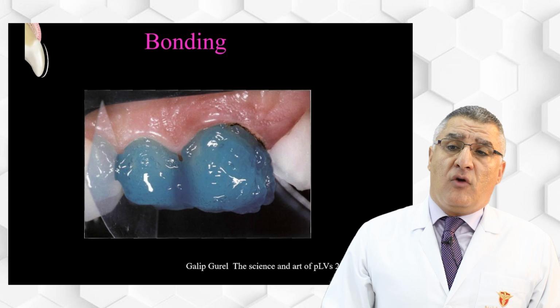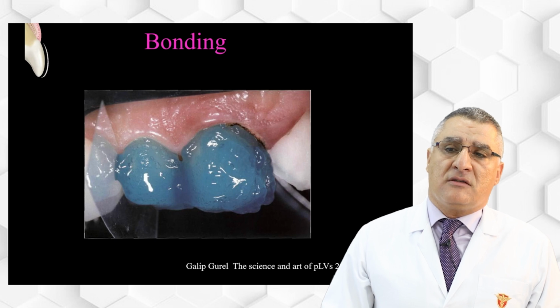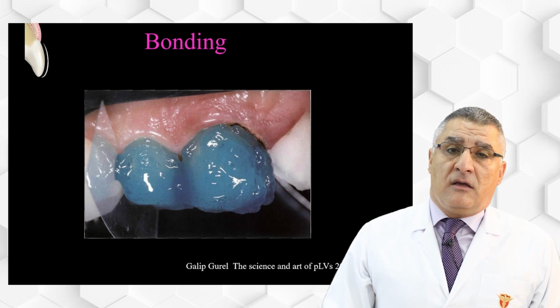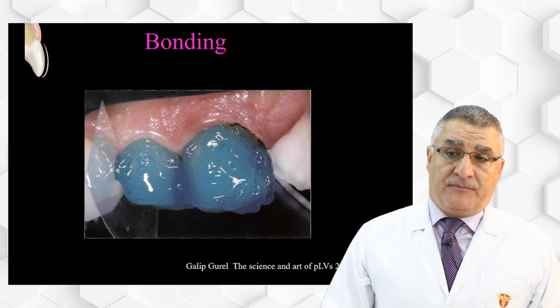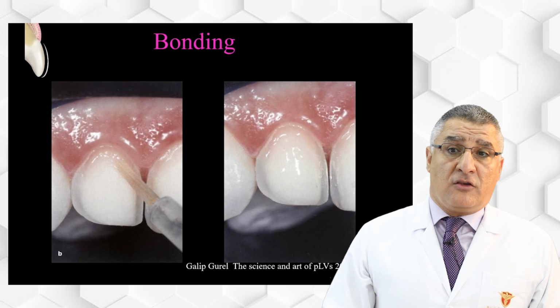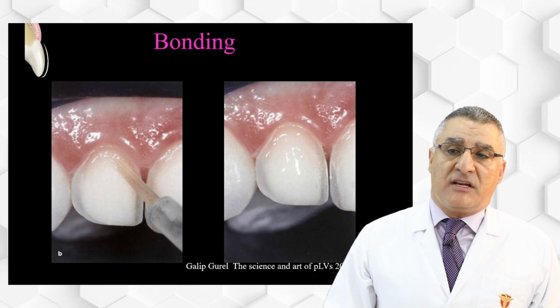You have to start with the two centrals, then lateral and canine, then the other lateral and canine. And during bonding, you have to protect the adjacent teeth from extension of the etch and the bond by using either celluloid strips or, preferably, Teflon strips. Make etching for the tooth, apply the bond, do not light cure the bond. We have to light cure the bond during seating of the veneers with the resin.